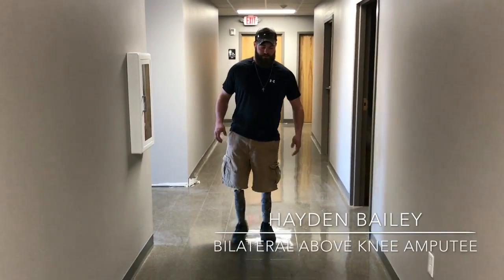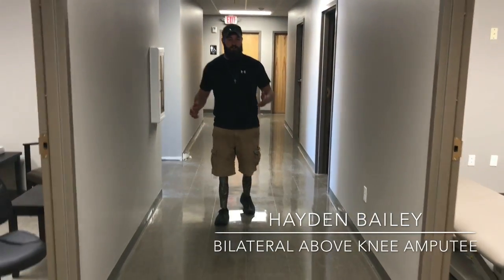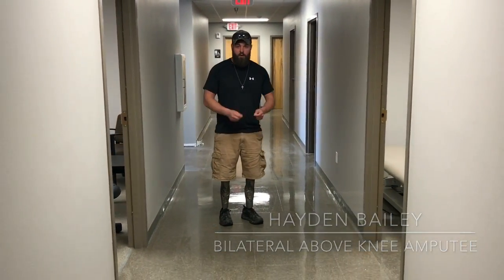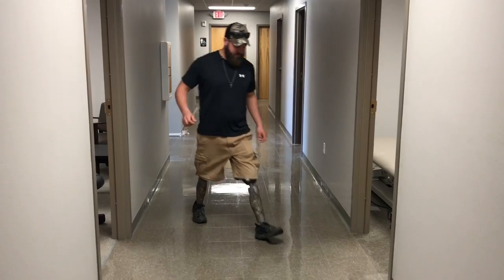I'm going to take a few minutes to demonstrate getting up from the ground as a bilateral above-knee amputee. You'll end up down there working on something or doing something.